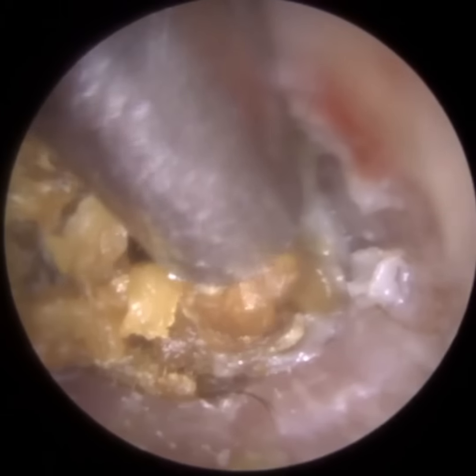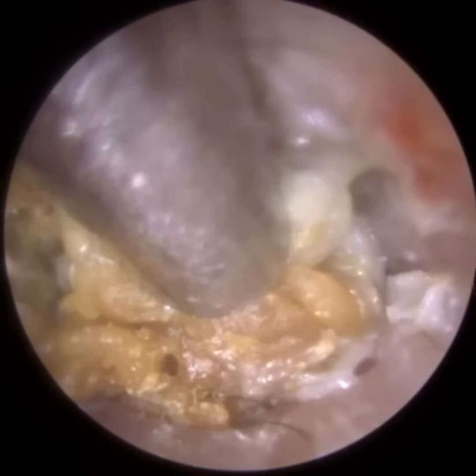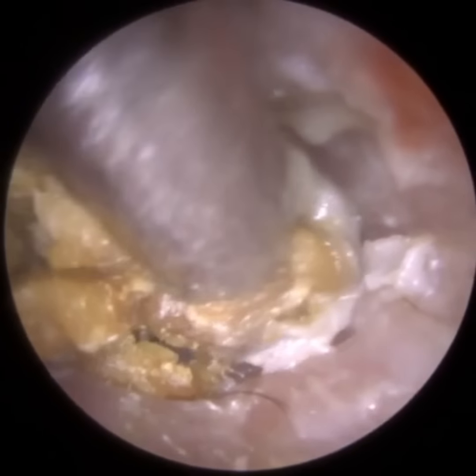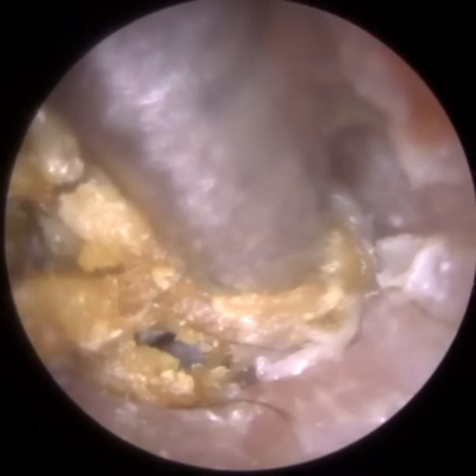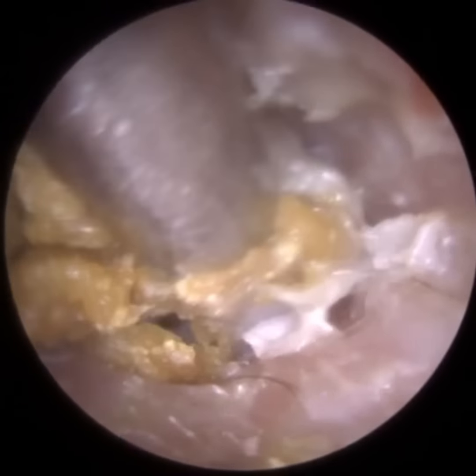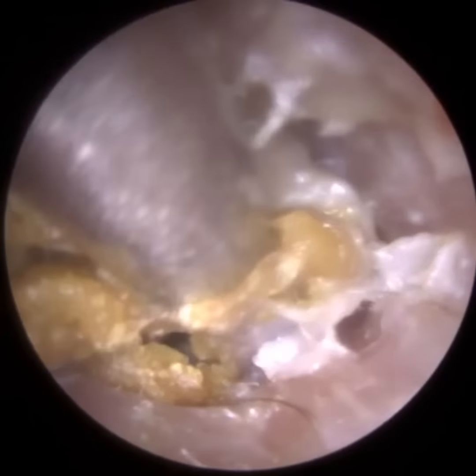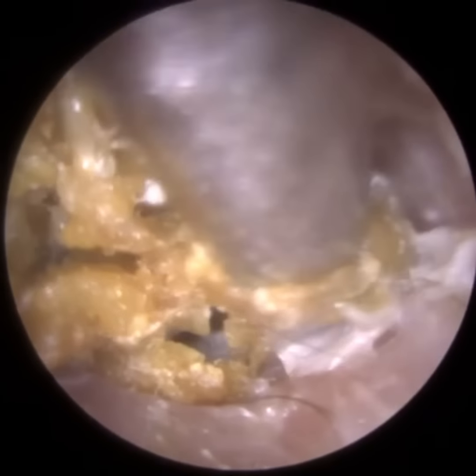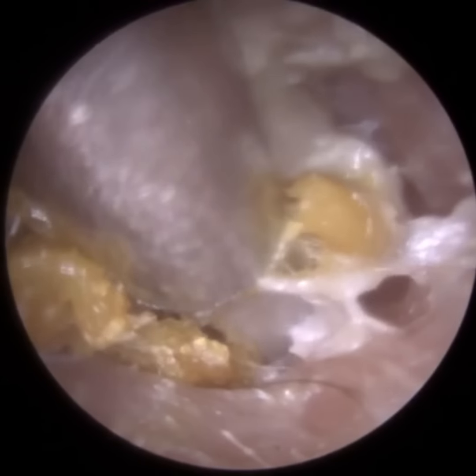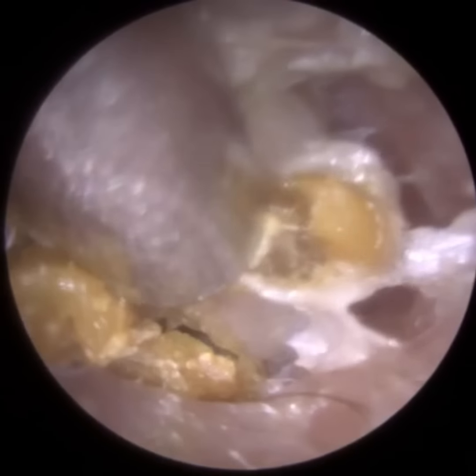And again, there's very little room for manoeuvre. So this is the full standard size Zonda suction probe, and it's taking up much of the ear canal. We've just got an amazing, fantastic view. This is the endoscopic view. It's unrivaled, unparalleled compared to any other visualization technique available, whether it be an otoscope or a microscope. You just don't see this. You don't get the same view.